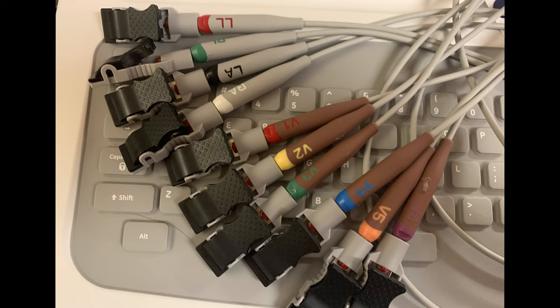The lead wires for the VU360 are labeled according to what electrode they attach to. Attach them to the corresponding locations and complete the 12-lead EKG as described in the video on the Mac VU360 EKG machine. That is included in the playlist linked at the end of this video.